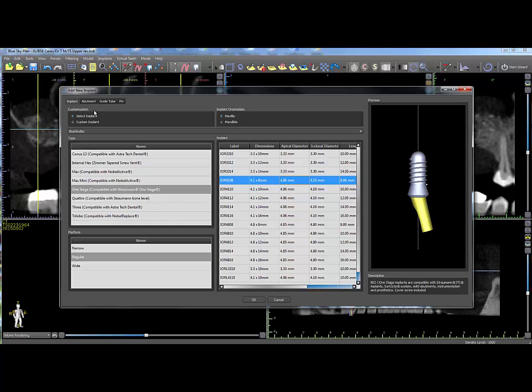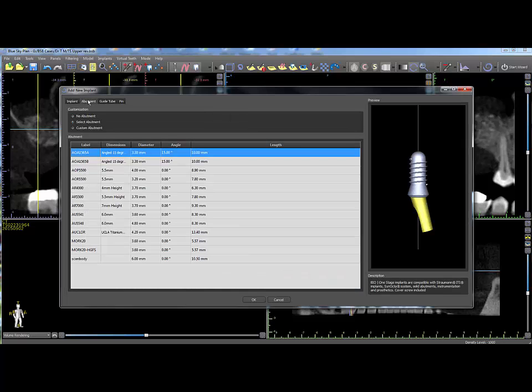To add an abutment, click on the Abutment tab on the top, click Select Abutment if not already selected, then choose the abutment desired.